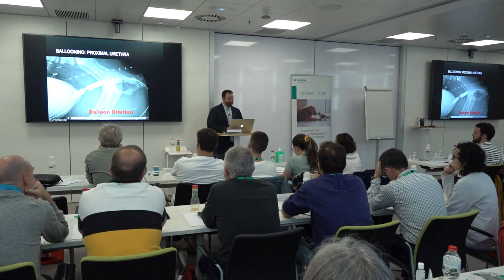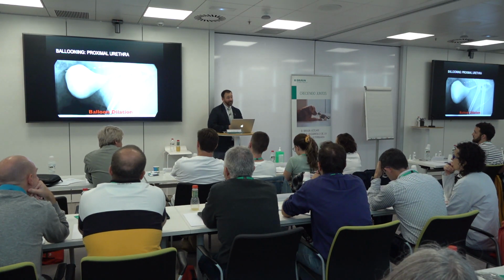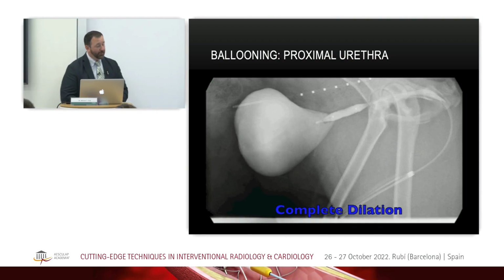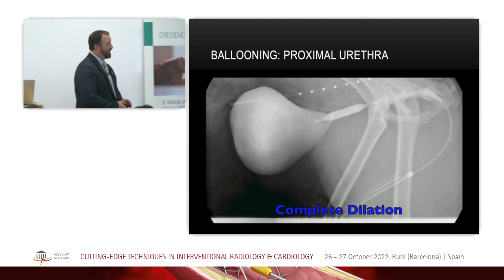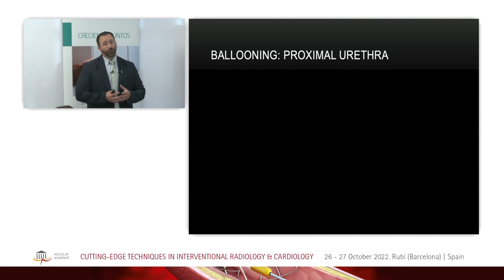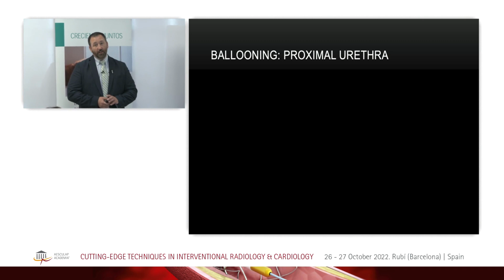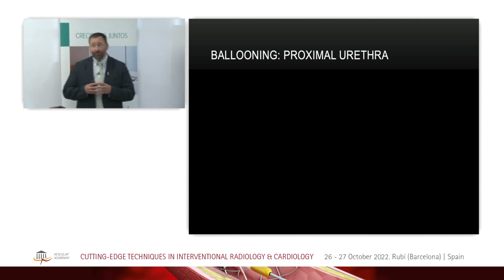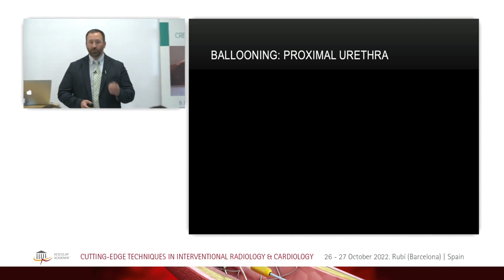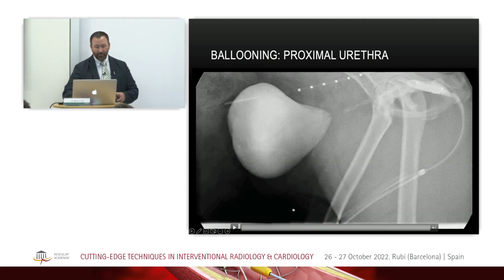Sorry, do you aim to have this fully distended or expanded on the first anesthetic event, or throughout? Good question. Do you try to get it done completely on your first anesthetic? Yes, because based on our experience, if you don't do that, you basically start over again the second time. So we try to go aggressively the first time, because even if we get rid of the waist on the first one, we'll come back on Wednesday and it'll already be kind of strictured back down again. That's why we've gone more to saying we're just going to do this for sure every single time. All right, I did not forget the question about leakage.